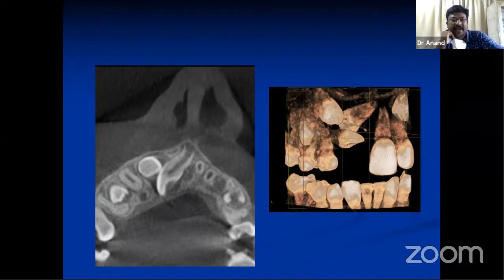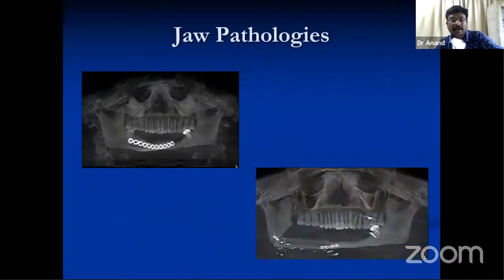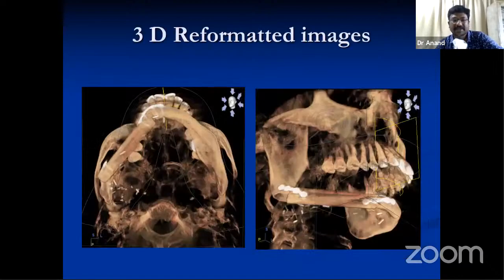So this is a simple case of an impacted tooth, where you can see a segmented version of the same area where I use the volume reconstructions to see the impacted tooth and the relationship with the adjacent tooth. So it gives you a clear idea how to proceed with the treatment. And it can be used for any number of jaw pathologies, right from ameloblastomas, KCOTs, any cyst or tumors. All these things would be ascertained with the help of this, right from any imaging modality. If you know how to interpret it well, obviously you will be able to interpret the same thing even with the 3-dimensional imaging modality. So this is a 3-dimensional version.